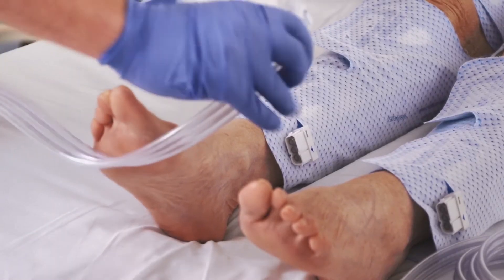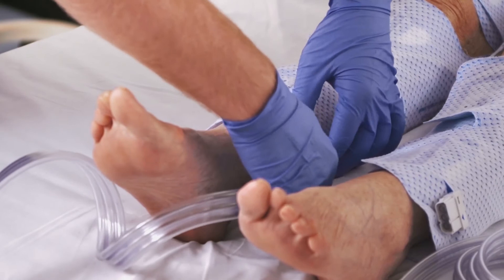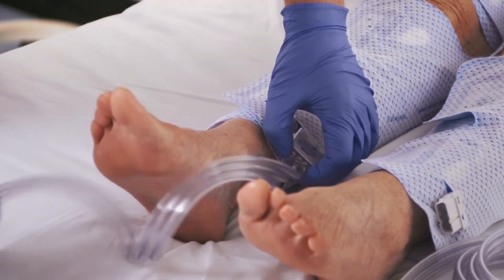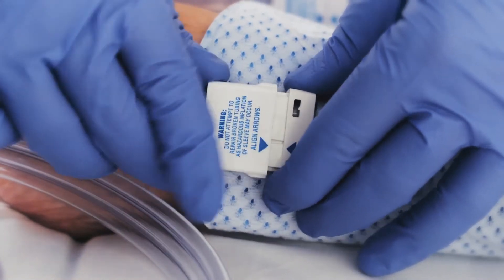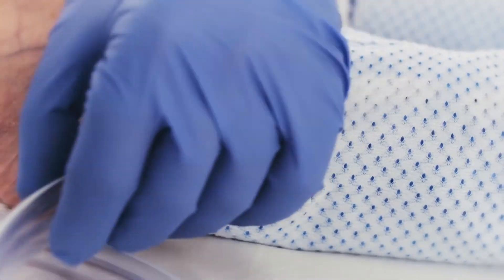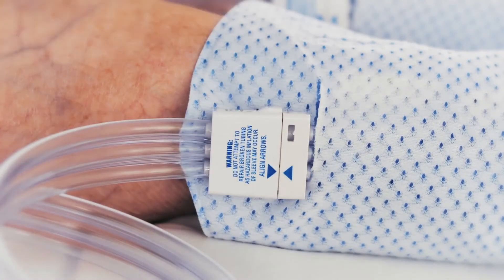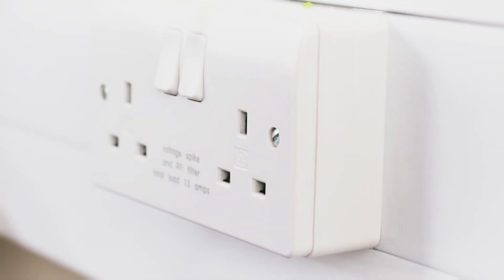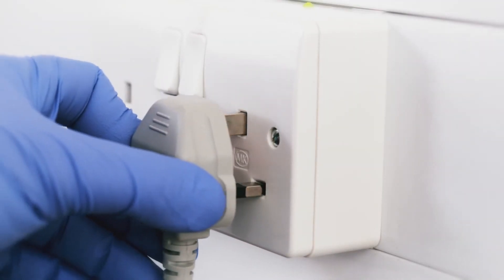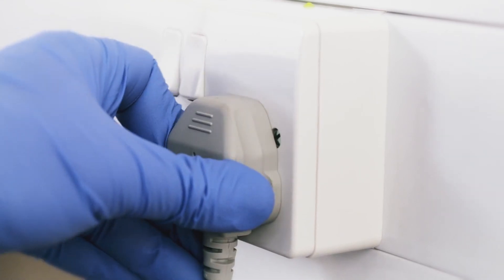Plug the tubes into the sleeves, checking for kinks and ensuring a secure attachment.